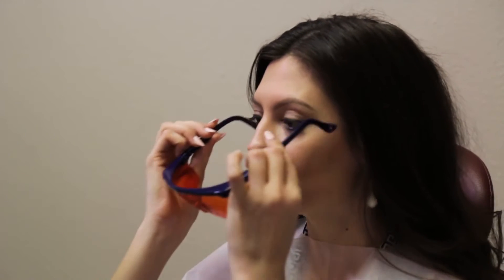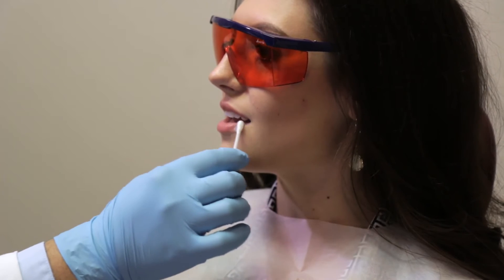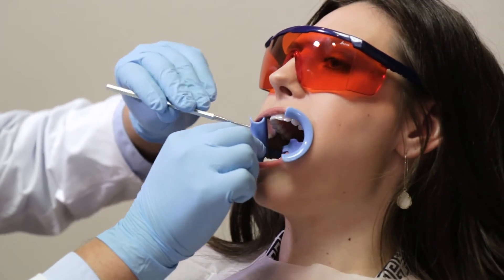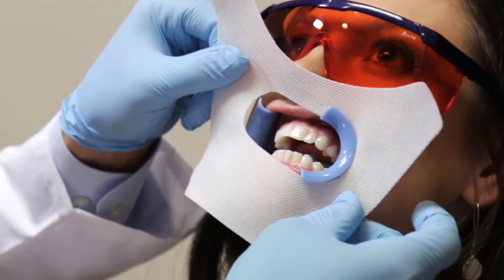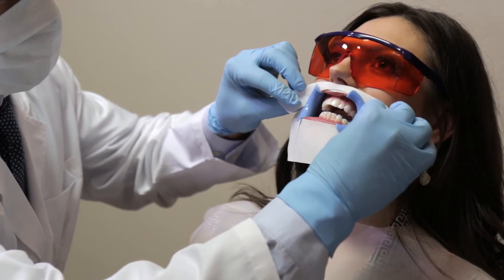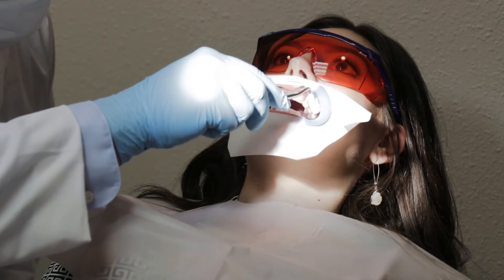Place the protective eye goggles on the patient. Apply lip protection cream and insert the Beyond FlexiBlue cheek retractor with the tongue guard pointing down. Stretch the face protection cloth around the outer rims of the cheek retractor and fold the top down under the arms of the cheek retractor. Insert cotton rolls on either side of the buccal frenum.